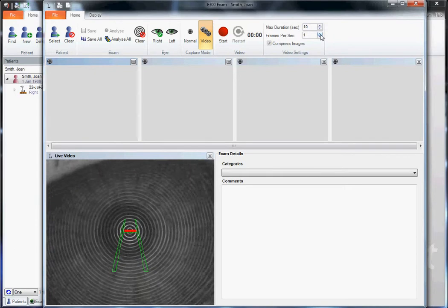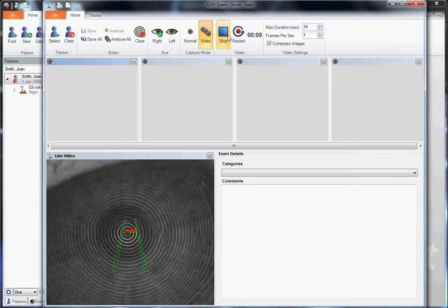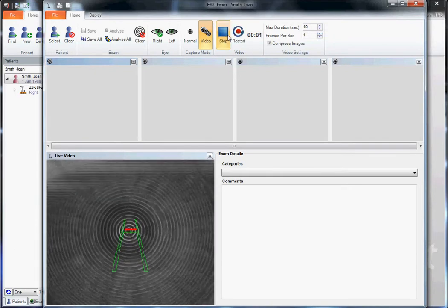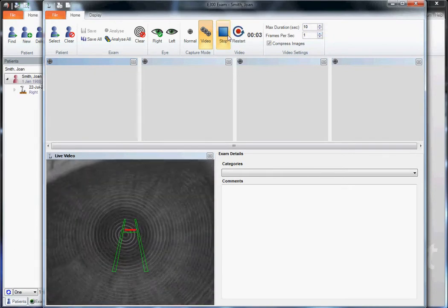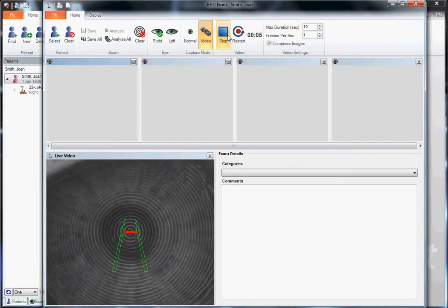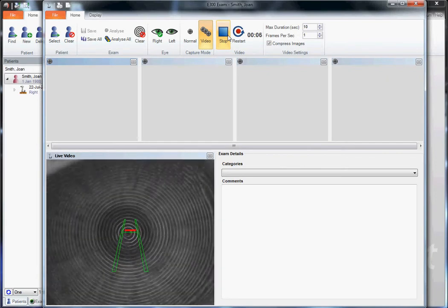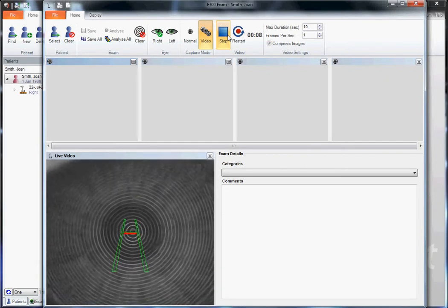When we're ready to take a capture we'll click start and immediately ask our patient to blink, and then we'll monitor the tear film over that 10 second interval.